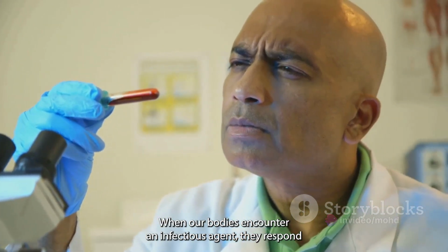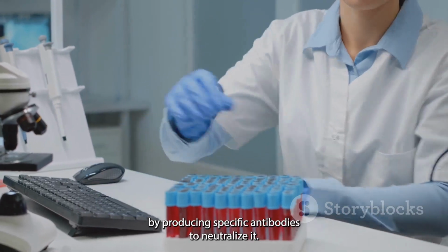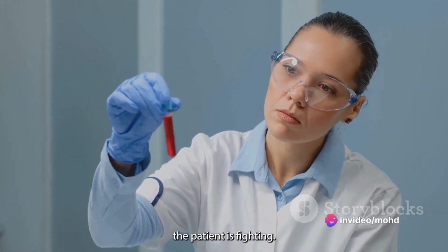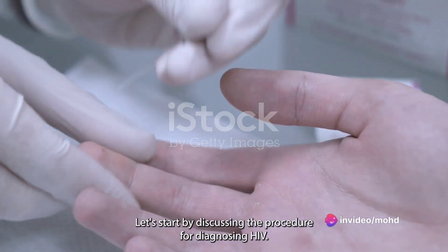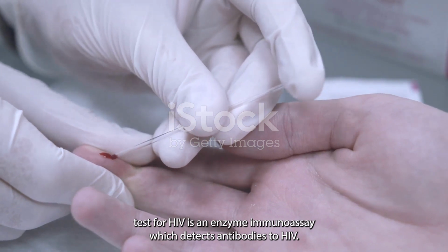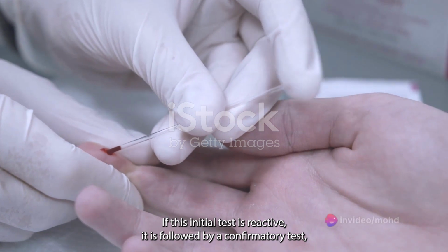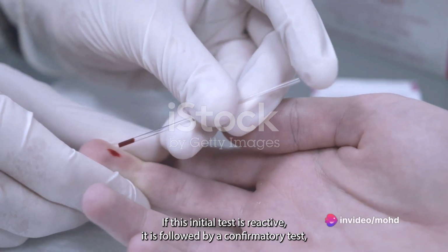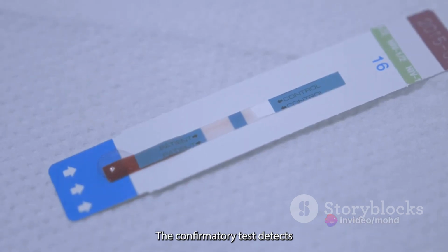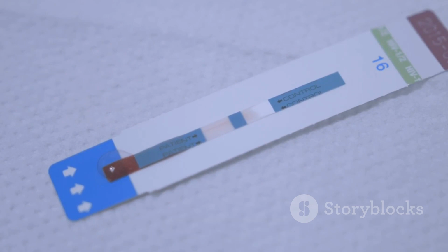When our bodies encounter an infectious agent, they respond by producing specific antibodies to neutralize it. By identifying these antibodies, we can pinpoint the disease the patient is fighting. Let's start by discussing the procedure for diagnosing HIV. The initial screening test for HIV is an enzyme immunoassay, which detects antibodies to HIV. If this initial test is reactive, it is followed by a confirmatory test, such as a Western blot or an immunofluorescence assay. The confirmatory test detects specific proteins of the virus, confirming the presence of HIV.